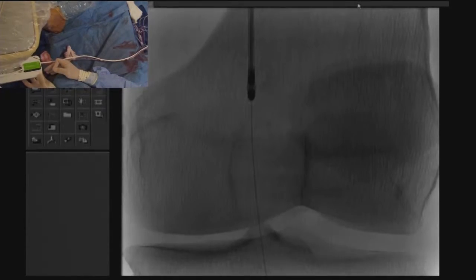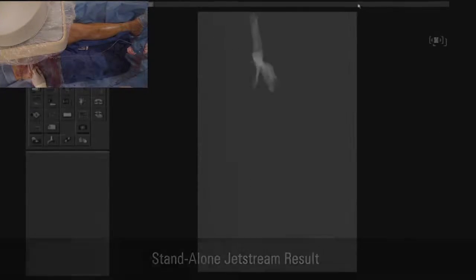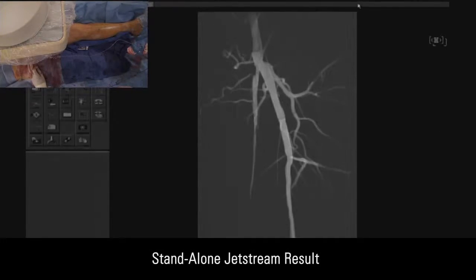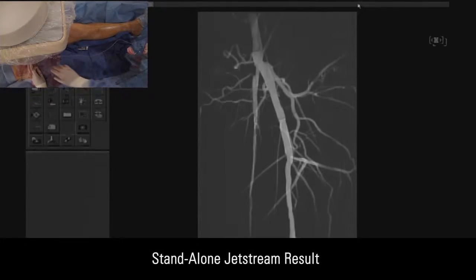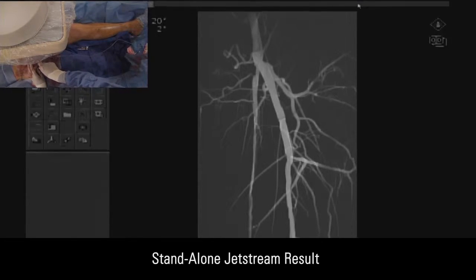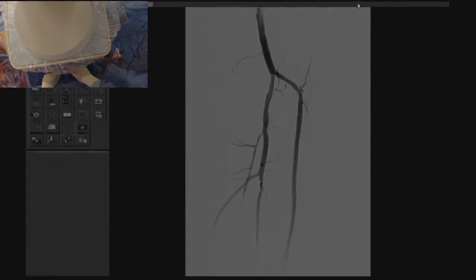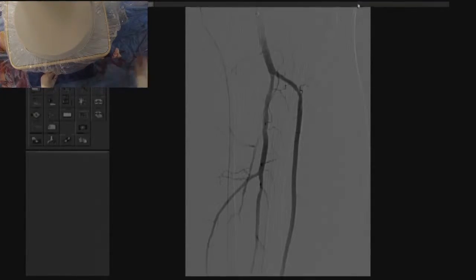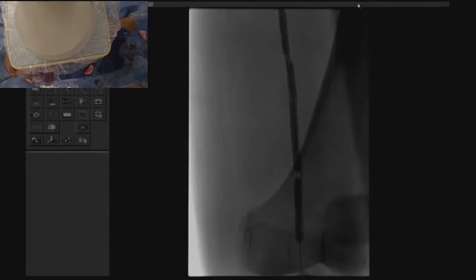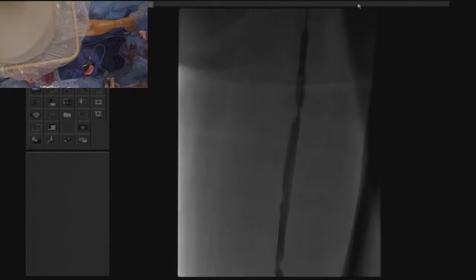Another tip with the use of the JetStream device: you have to be mindful of your ACT. Pushing your ACT beyond 250 is worth it in some of these complex cases. This is an angiogram after performing aspirational atherectomy with the JetStream device.